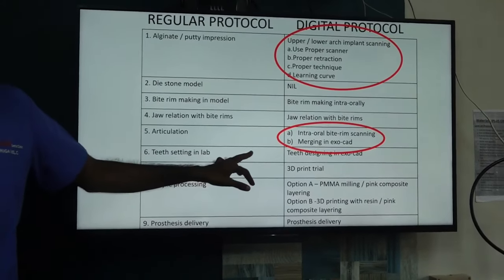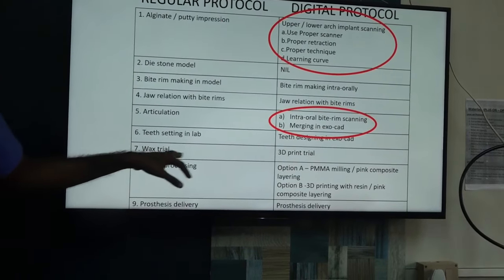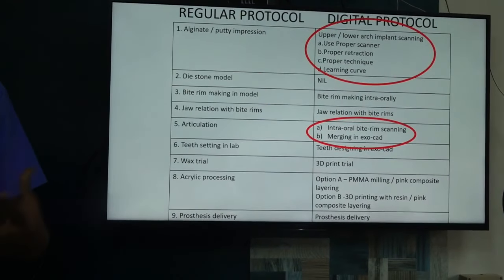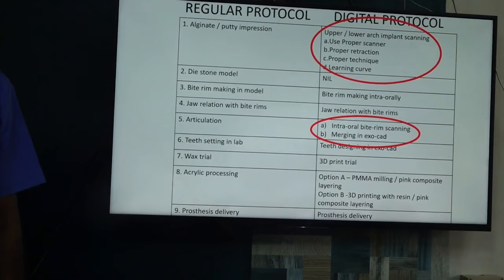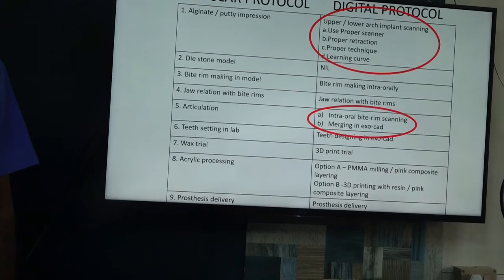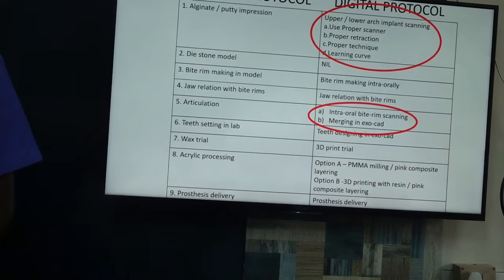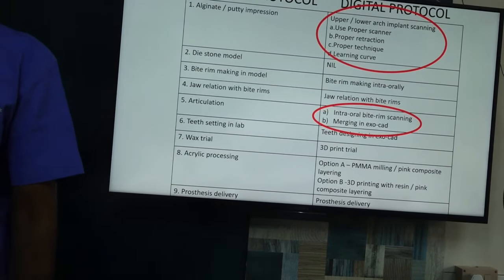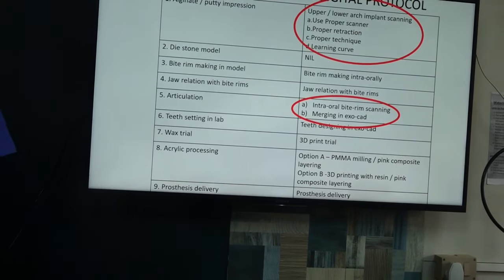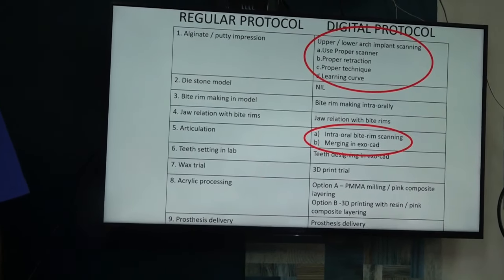Here, teeth setting, trimming and tooth setting in the lab. Here, designing in the CAD. After that, it is similar. Wax trial is similar to 3D trial, but it becomes more convenient. You can ask the patient to bite whatever they want. You can put the 3D trial and send the patient home also. It won't melt, it won't dislodge, it won't displace. The only problem is you cannot immediately do some changes and see. With a wax style, you can immediately move the tooth and within 10 minutes you can see another. But here you have to redesign it.